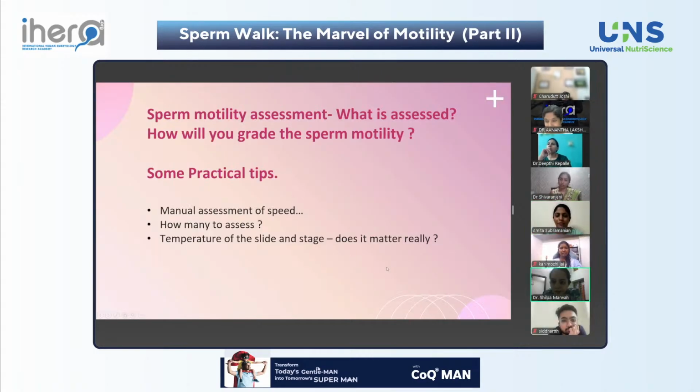See, if it is above 50 million count, I think plus minus 5 million is okay. 5 to 10 million is okay. If the sample count is low, it's below 20 to 25%, I think we cannot take risk. Yeah, you'll have to retrain them.